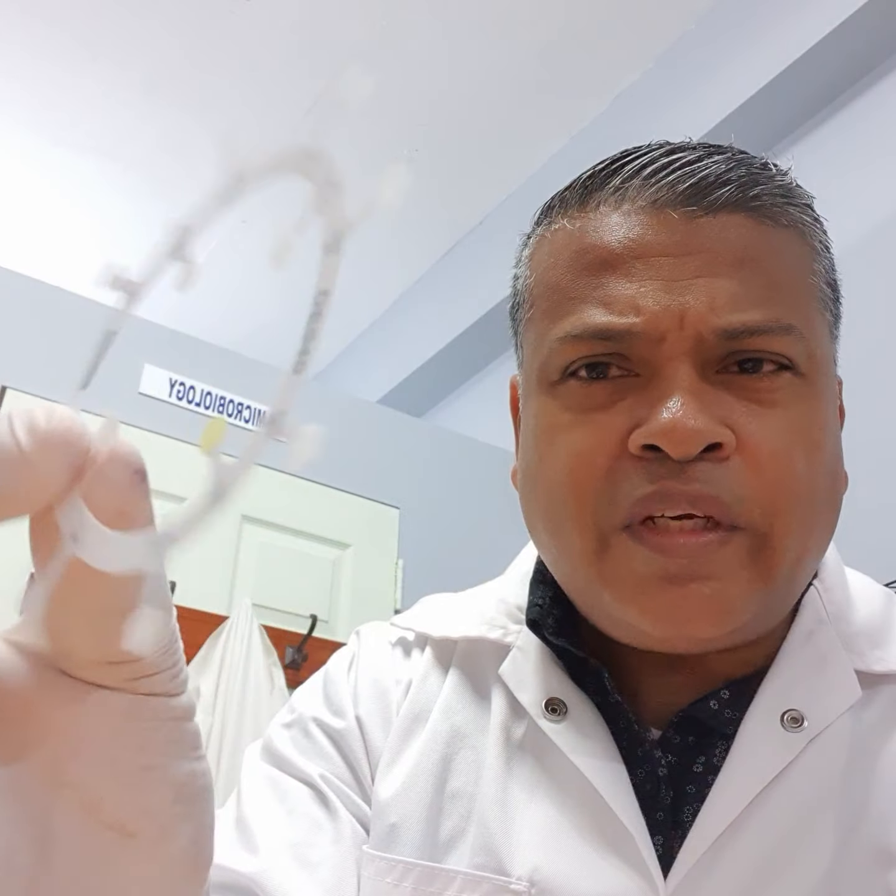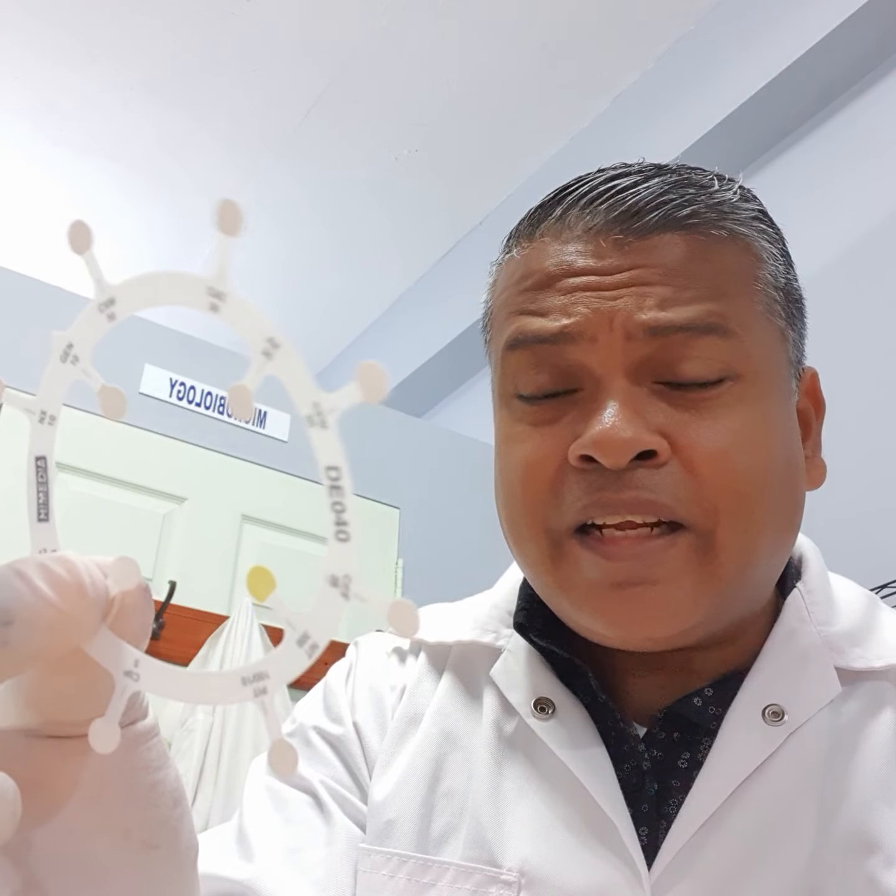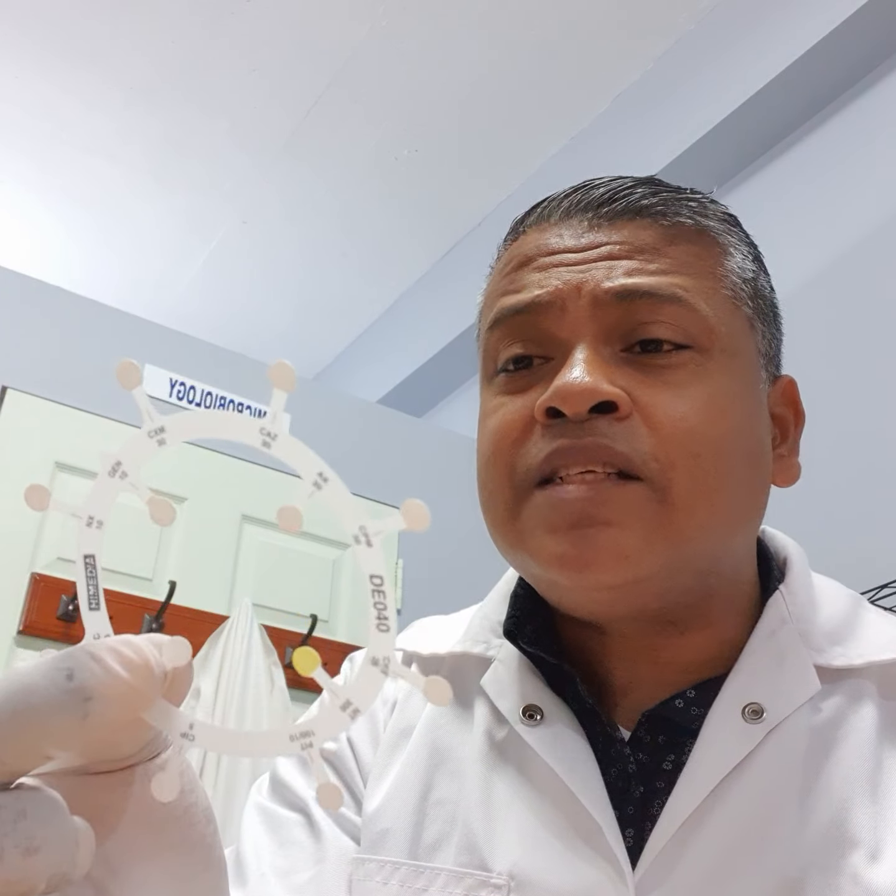The S is the sensitivity test, where antibiotics are subjected, and what these antibiotics look like are, well, in this laboratory, we've got antibiotic ring structures, where each one of these circles is an antibiotic, a disc that has been impregnated with an antibiotic. Cefepime, amikacin, ceftazidime, cefuroxime, gentamicin, all of these. And these are placed on another plate where the organism was seeded. And then we look for what is called zones of inhibition. That is what is going to tell the physician to write a prescription for that antibiotic or another one, etc.